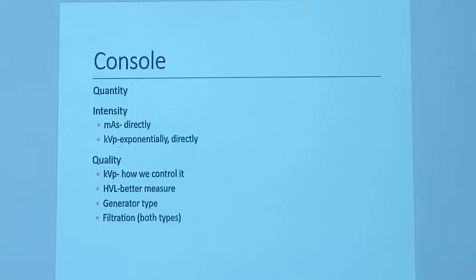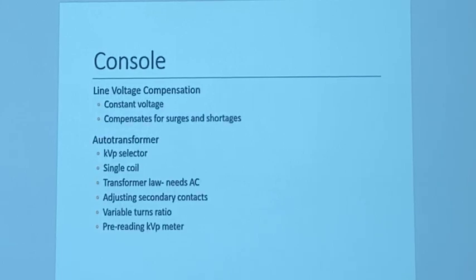You may have wedge filters and trough filters and things like that. And realistically, have y'all seen any kind of added filters? Any kind of compensating filters in clinicals? In a lot of ways, the digital processing has kind of replaced that. They still do have applications, but they're not as critical as what they were with screens and films. In order to get a good image of the foot from toe to heel, whenever we're using screens and films, you had to use a wedge filter. You just don't have to do that anymore. It still does have an application, but it's almost theoretical.